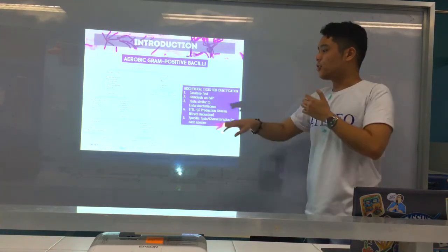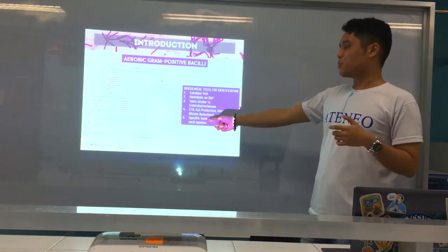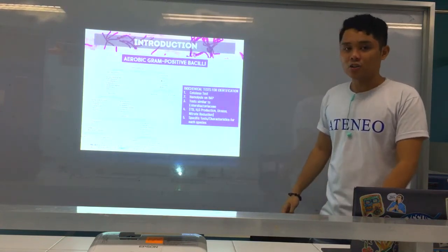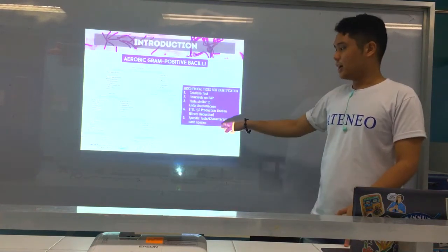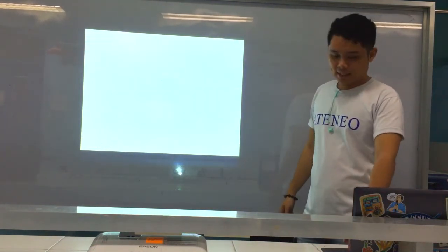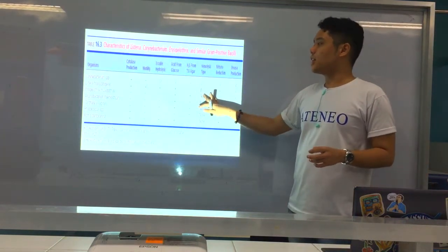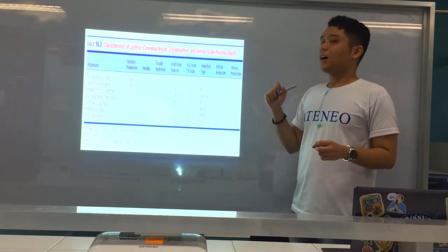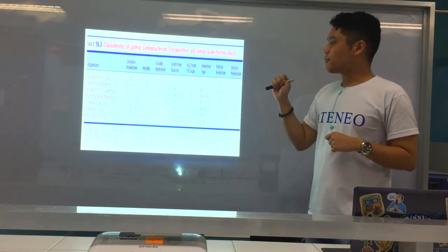Okay? Alright. So, again, their tests are quite similar to Enterobacteriaceae, like H2S production, TSI, triple sugar iron, urease, and nitrate reduction. And we have the specific tests or characteristics for each species that we will look into today. Okay, so we'll start first with the first test. For this table, these are examples of a summarized tabular summary of some of the aerobic gram-positive bacilli. So, I'll just point out some important stuff.